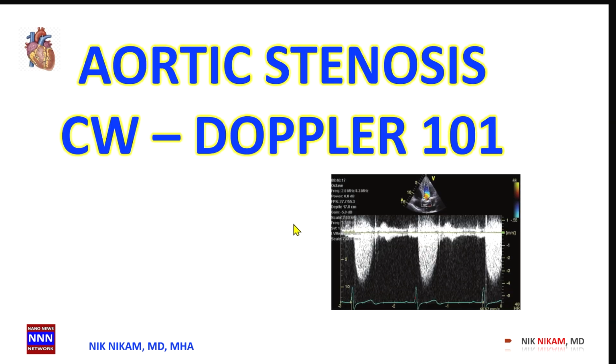So ladies and gentlemen, this is a quick synopsis of the Doppler 101 in patients with aortic stenosis.